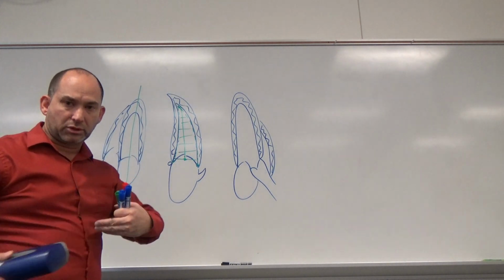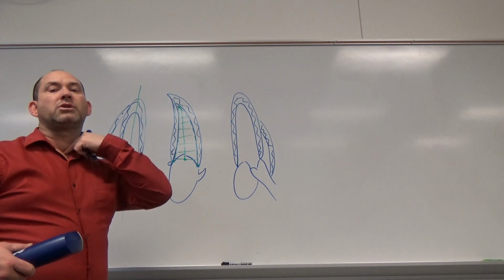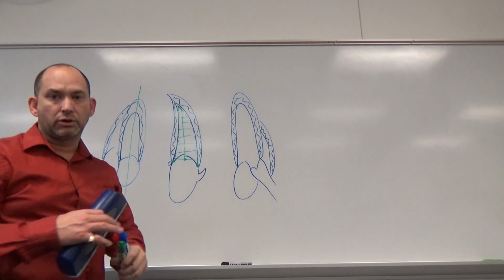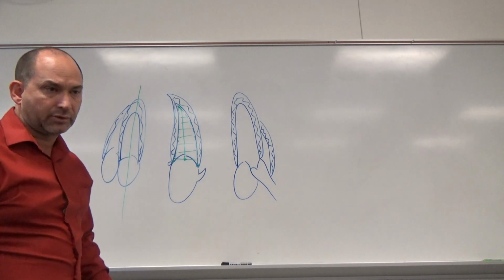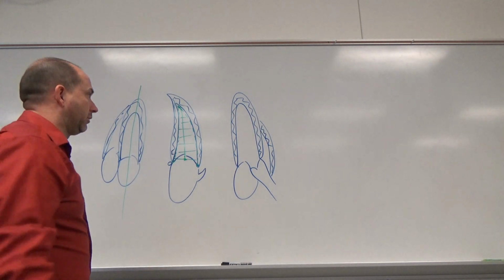Further than this, we would be looking subcostal from underneath up through the liver, and suprasternal notch up in the neck, looking down at the aortic arch and the vessels and stuff up in those areas. Beyond that, that is an echocardiogram.